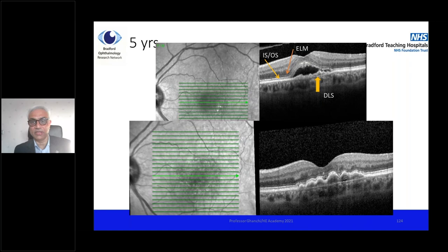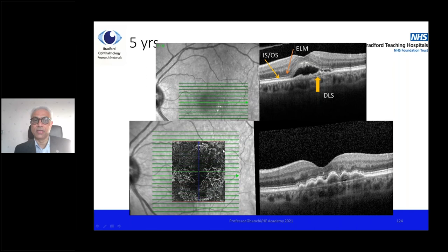This patient was seen five years later. There was no sub-retinal fluid at the time, but the pigment epithelial detachment had swollen up. You can see the double-layer sign quite clearly in the bottom picture. And if you do an OCTA scan, you find the network of blood vessels.